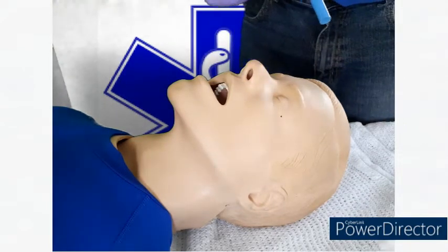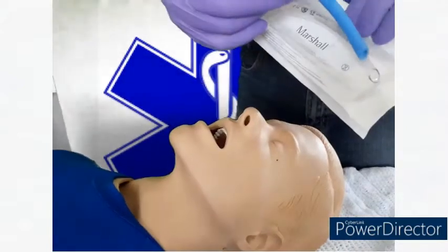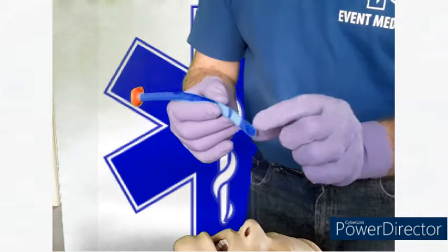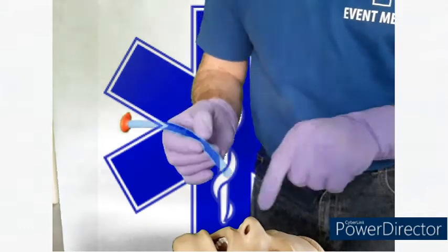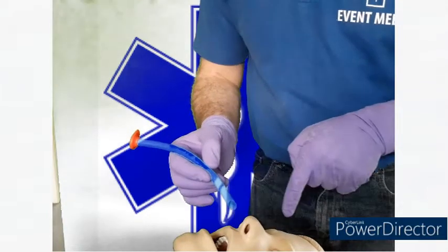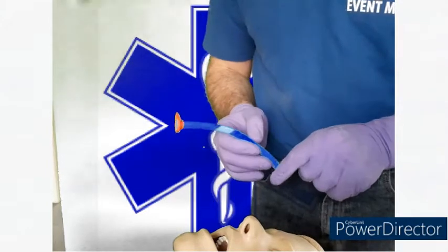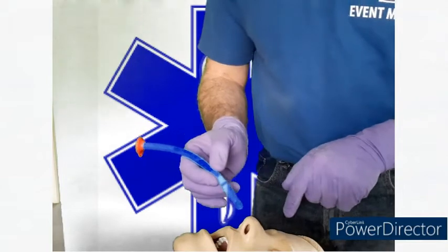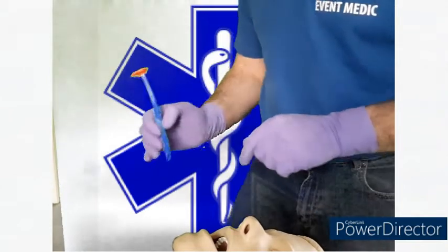So if we look at our nasal pharyngeal, it's already got a curve to it, and there's a chamfer on the end. We always start with that chamfer towards the septum in the nostrils. So the right hand nostril, which is normally slightly larger, is where we're going to start. And we want to get some lubrication.